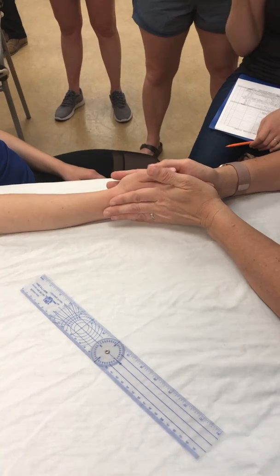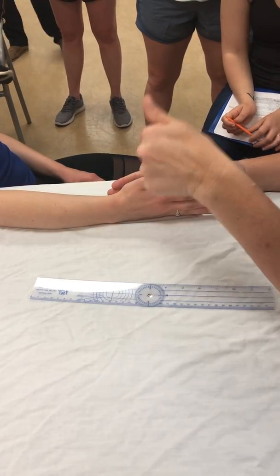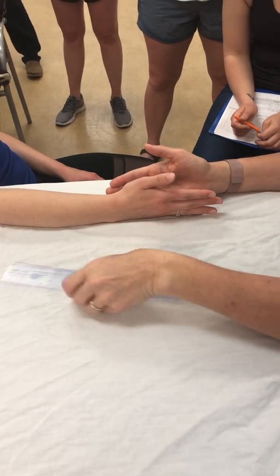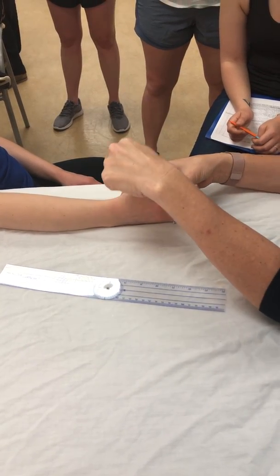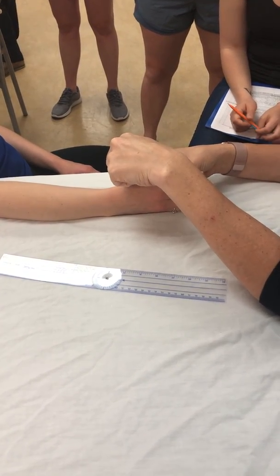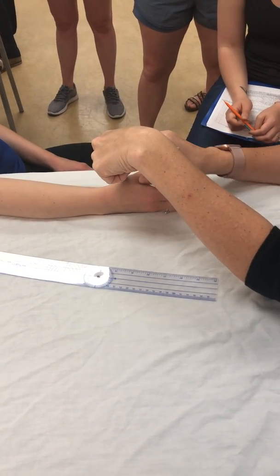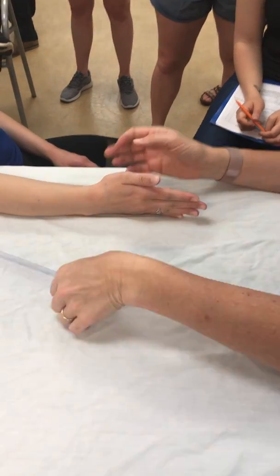So if we want to measure this motion, we want to put the axis of the goniometer perpendicular to the motion itself, okay? So if we want to measure abduction, we want the axis to be going this way through. Think of sticking a pin through the axis of the goniometer so that the movement can happen around that axis, to help you remember.